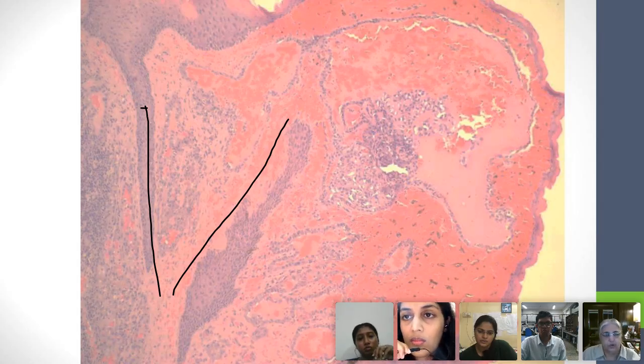First of all, I want to know what is skin. Will anybody dare please tell me what is skin? I know it sounds like I'm asking a stupid question, but I want to know, particularly because Kshitija thinks that this is skin. What is skin? Ma'am, skin is made of epidermis and dermis, and the epidermis is keratinized stratified squamous epithelium. So now, according to Kshitija, this is skin. Why? Because there is squamous epithelium, it becomes skin? I don't think so. Why should it be skin?